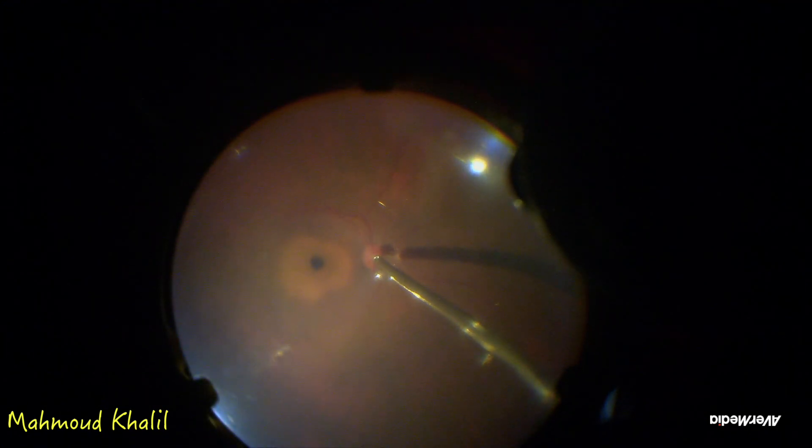This was assisted with the aid of peripheral PFCL. Peripheral PFCL pushes the flap against the macular hole. It is worth stressing that there is no need to insert the ILM flap inside the bottom of the macular hole, so as not to damage the retinal pigment epithelium — just leaving the flap on the surface only.